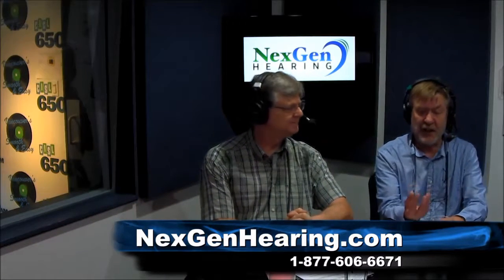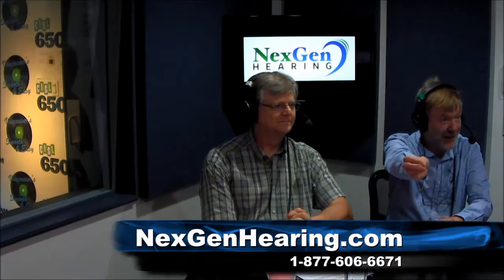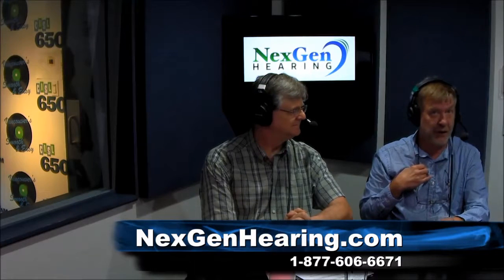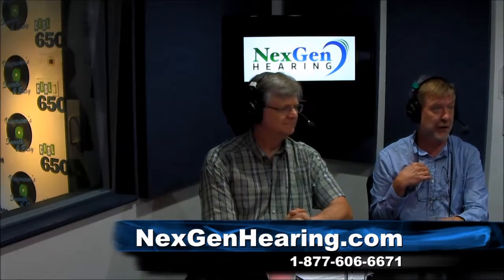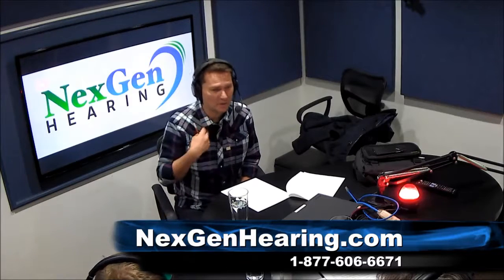In a way, you can think of it like bringing the hearing aid up to the lips of the speaker. In an analogy, that's how you can think of it. Right. As Mike says, the person speaking who does not have the hearing loss is wearing the mic on his or her lapel. All right, well, that's great for somebody who's taking a night class or something like that. But in real everyday life, does the spouse wear the mic typically?